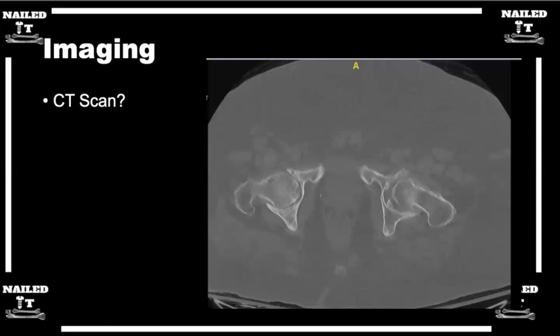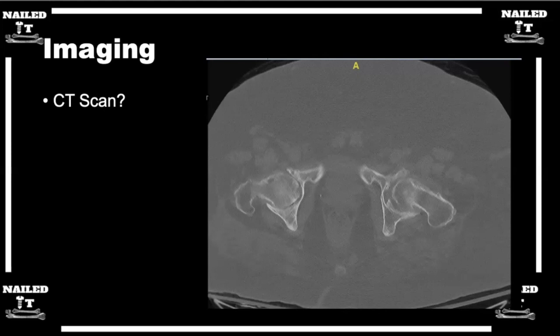Are you getting a CT scan for every case, or is it for questionable displacement? For me, a CT scan is helpful when I don't fully understand the fracture pattern — for example, if we're trying to decide whether it's truly displaced or impacted and the lateral view doesn't help, or whether it's basicervical versus transcervical. This CT scan you're showing has a little bit of arthritic change. If you're worried about a cyst or a potential pathologic fracture, CT can help in those settings as well.